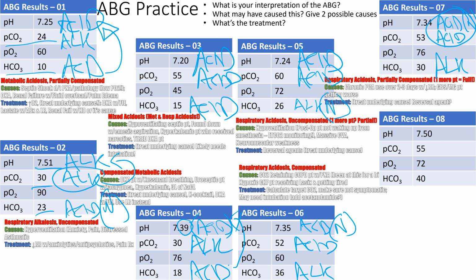Okay, all right, so 8, what is that? Good, alkalosis. What caused it? Was it the CO2? So you kind of want to answer each one. So CO2 55 is high, which is acid. So that's not what caused it. So it's probably the other one, right? Something caused it. It was either the CO2 or the bicarb. If you can't remember which one's which, right?